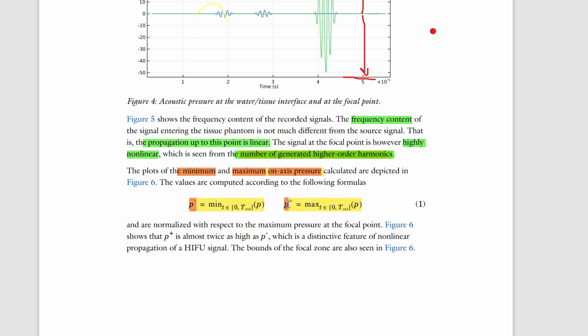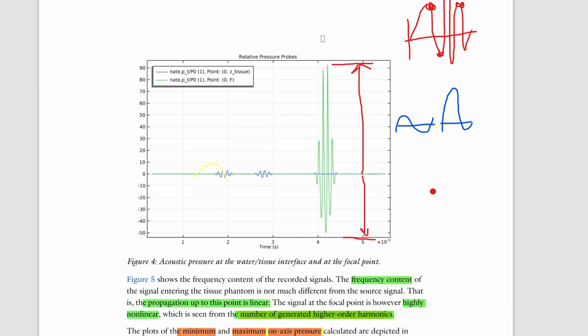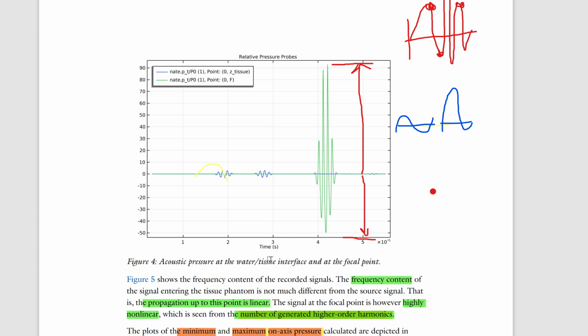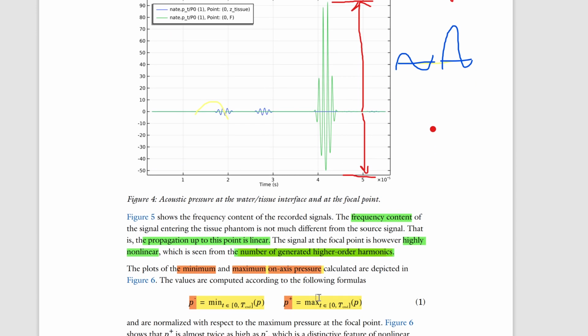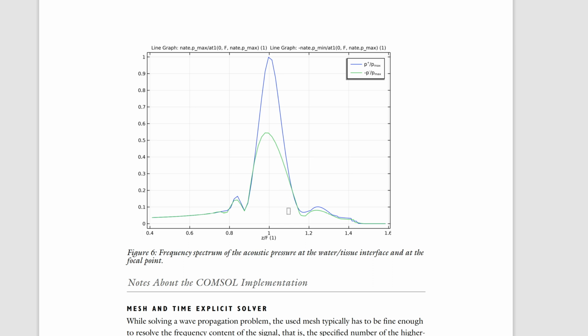Maximum this. Rest, not feeling too certain about it, but it says here, let's look at Figure 6. P maximum. Oh, this must be, I think I'm getting this now. Is it this guy? Or is it with our Fourier? No, it's this guy. So, for positives and negatives. Where was it here? Minimums and maximums. On axis pressure. So, I think this is over time from 0 to the end of time. Pressures. And if we go to 6, maximum. Yeah, maximum here. And negative maximums.